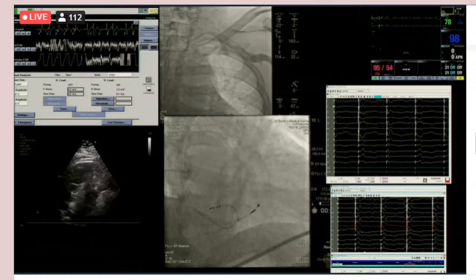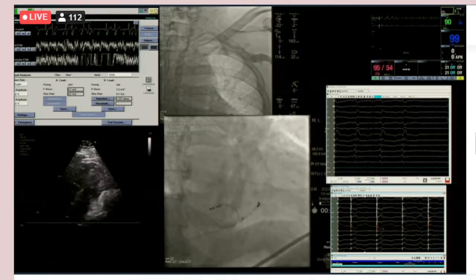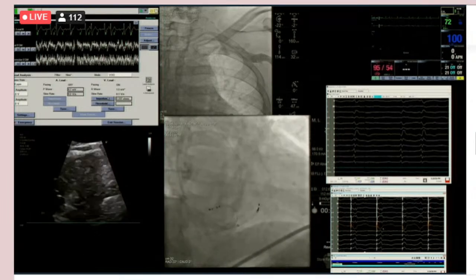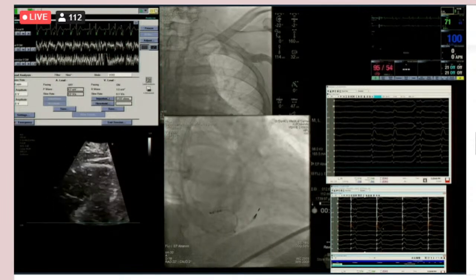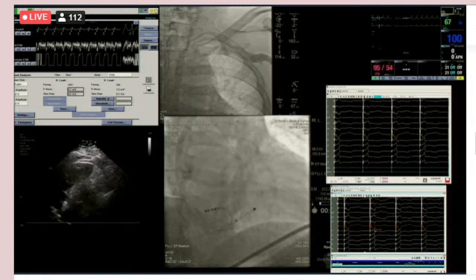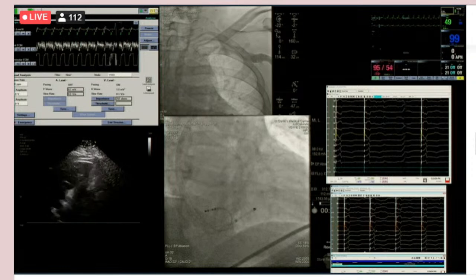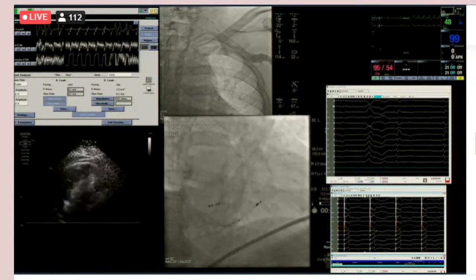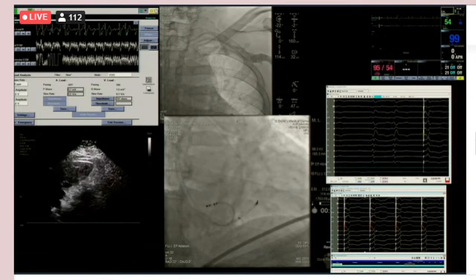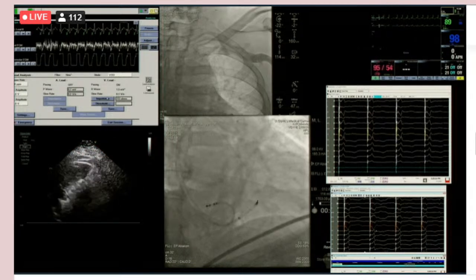Okay, the morphology doesn't look bad, so you've got the QS. Yeah, you see that. Looks like it's taken the cord. So there's a question about how much do you screw it in? What's the end point to be satisfied? So here's what we're doing. As I'm screwing it in, you see how it still has a QS, but the S is a bit later and a bit shallower than it was a minute ago. So that suggests that I'm actually drilling into the septum. The end point is you want to see that terminal S become an R wave. See how it's starting to become an R wave now? Yep. So now it's a QR, although the Q is bigger than the R.